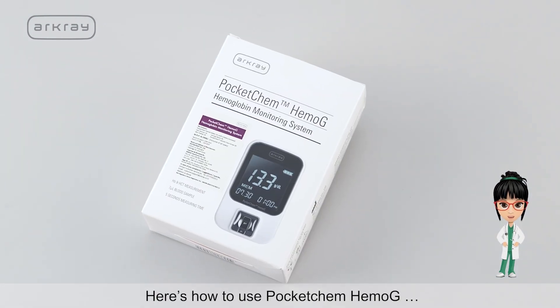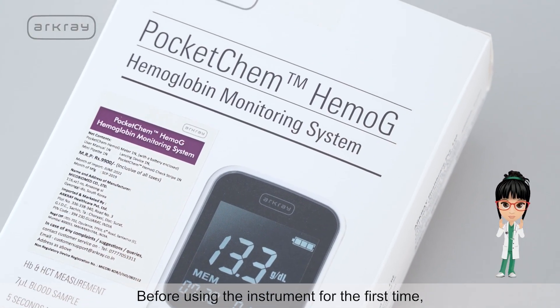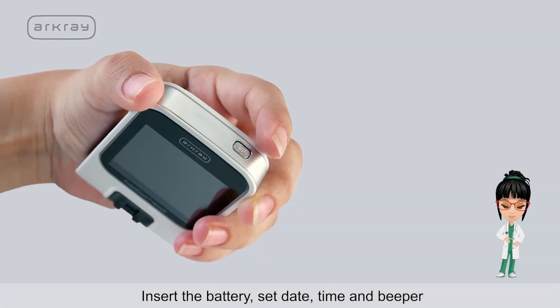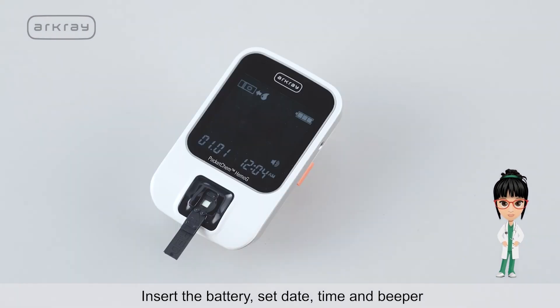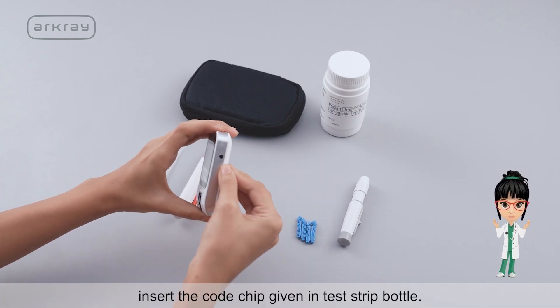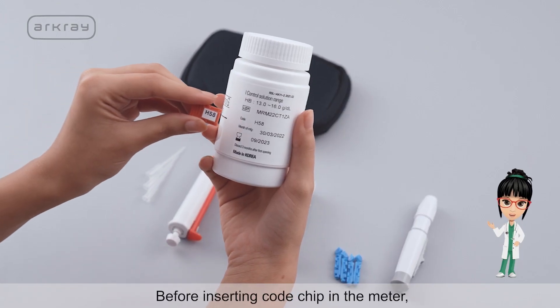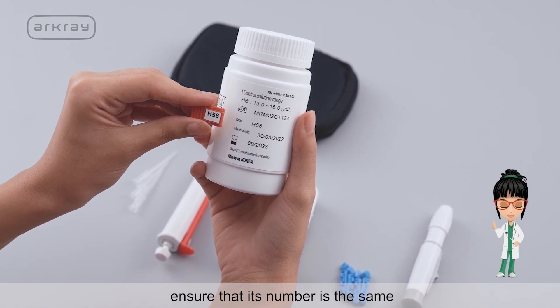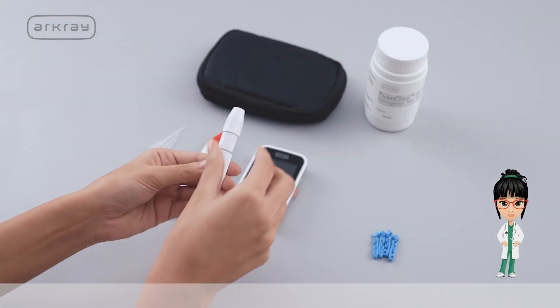Before using the instrument for the first time, prepare the following: insert the battery and switch on the machine using the upper power button. Press the side button to set the date, time, and beeper. To calibrate the device, insert the code chip provided in the test strip bottle. Before inserting the code chip into the meter, ensure that its number matches the code number written on the test strip bottle.